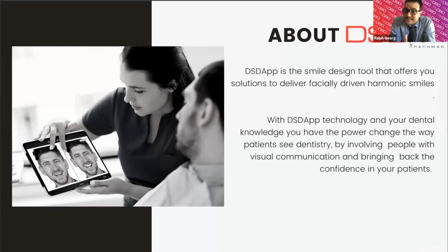It's a smile design tool that offers you solutions to deliver facially driven harmonic smiles, very important, harmonic smiles. With our DSDAPP technology and your dental knowledge, you have the power to change the way patients see dentistry by involving people with visual communication and bringing back the confidence in your patient. So this is a great tool that also helps you increase your treatment acceptance.